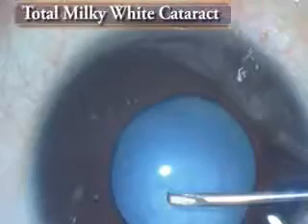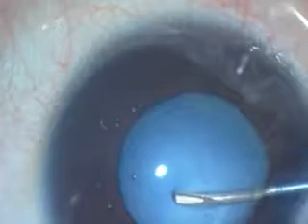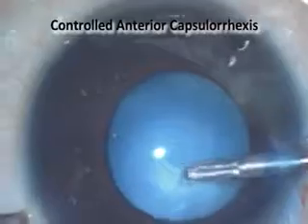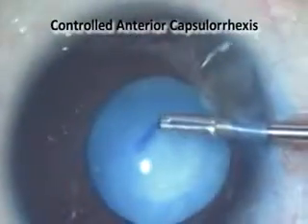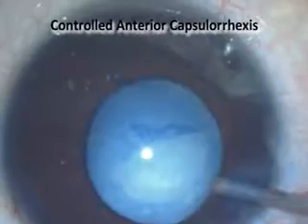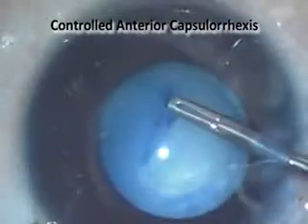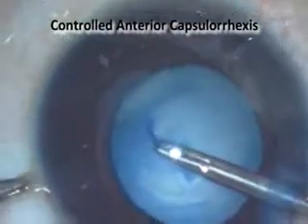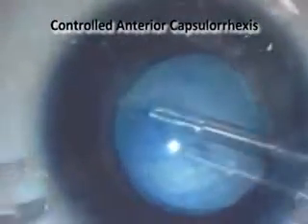In total milky white cataract, stain the anterior capsule properly with trypan blue and gently initiate a continuous curvilinear capsulorhexis with a cystotome. Complete the capsulorhexis with a pediatric capsulorhexis forceps. Avoid vigorous pressure during rhexis and direct the force towards the center of the nucleus, and defer any hydro procedure as it can cause posterior capsular rupture if there is an underlying posterior capsular plaque. Remember that the complete removal of all cortical matter to avoid intense post-operative inflammation is mandatory.